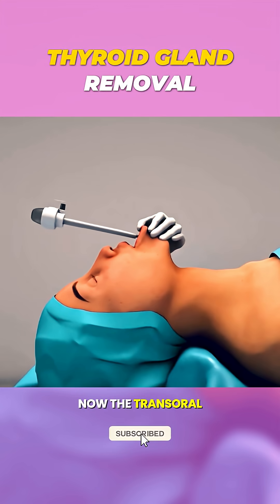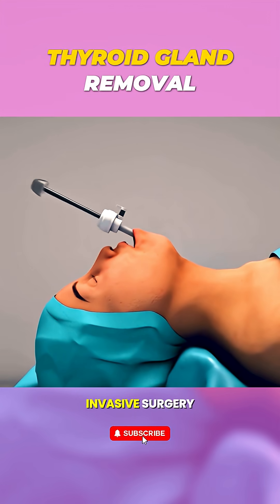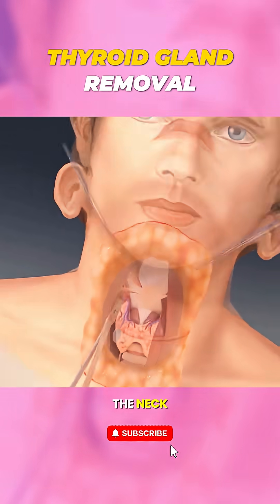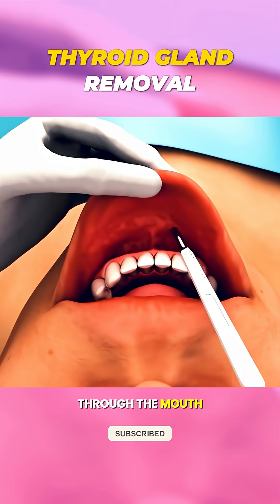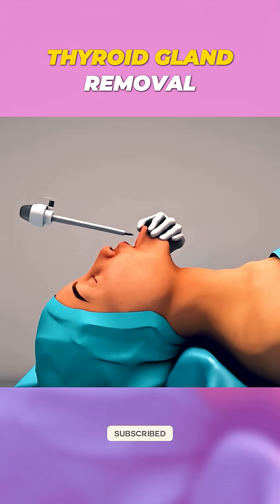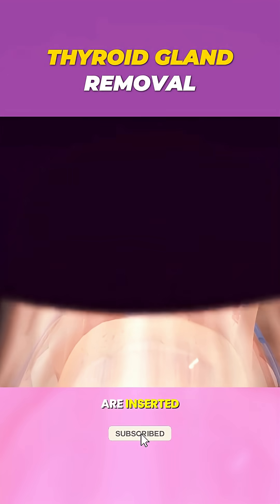The transoral endoscopic thyroidectomy is a minimally invasive surgery. Instead of making a cut on the neck, the surgeon goes through the mouth. First, small incisions are made inside the lower lip. Through these, tiny cameras and instruments are inserted.